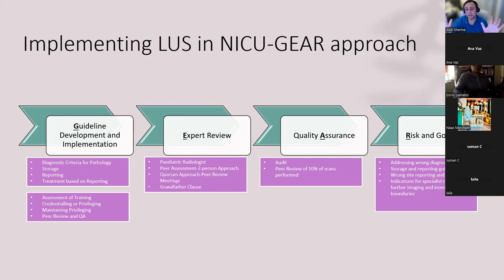We're not going to be experts in the diagnosis of congenital diaphragmatic hernia for young babies, I mean, absolutely no doubt. We're going to get an X-ray done. We're going to talk to our surgeons. So really that might not be part of our guideline to start off with, but the diagnosis of common things like a pneumothorax, pneumonia, meconium aspiration, differentiating RDS from TTN, the bread and butter stuff, would be something that could easily be defined and which all of you have demonstrated good skills in.